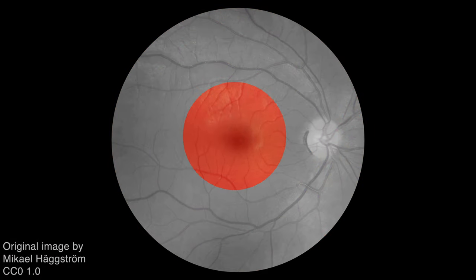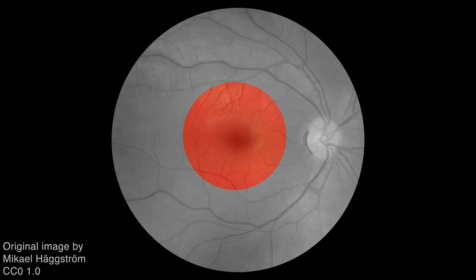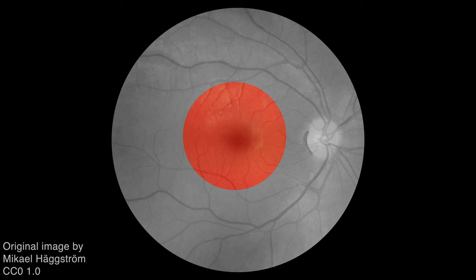This is the macula, which is located temporal to the disc. The fovea is a small area located in the center of the macula, which is void of visible vessels.